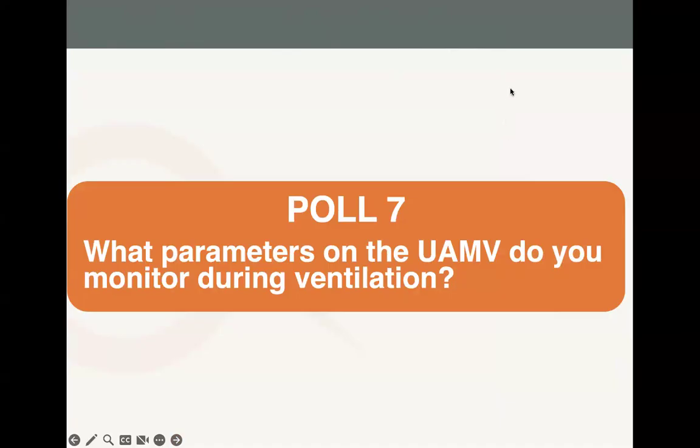Okay, so once you have changed the bellow isolator switch, and then you start the case. And remember, you have reviewed your parameters, you have reviewed your alarms, hoping everything is okay. So now, what are the parameters you have to monitor when the patient is on mechanical ventilation?